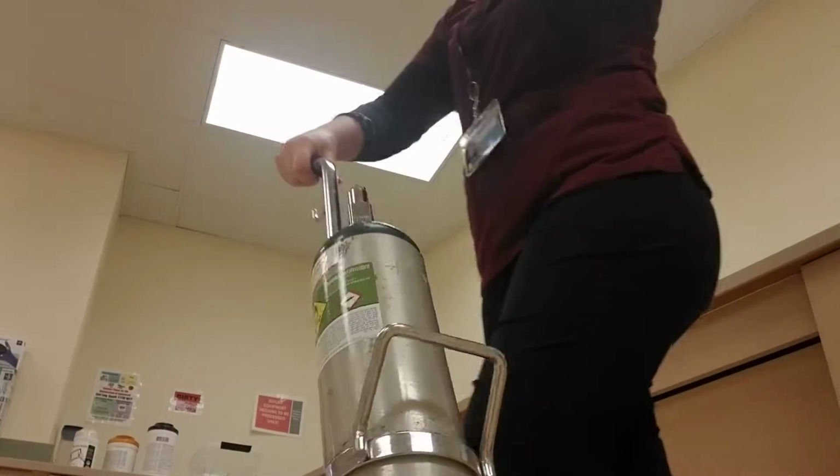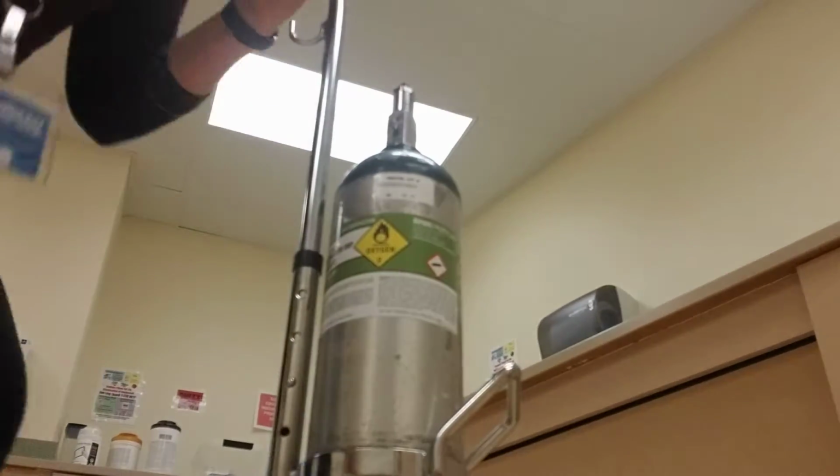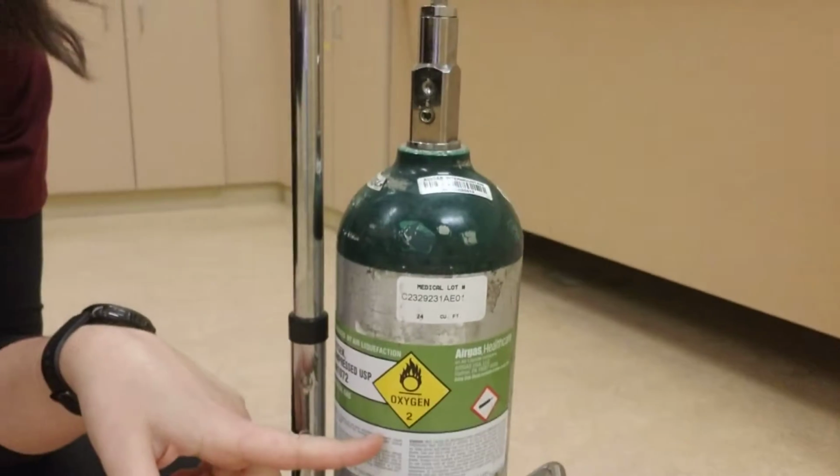I'm going to bring your oxygen tank over using this little trolley. Make sure it's secure, all upright position. We know it's an oxygen tank because of the green coloring. We can read the labels here. That's oxygen. You can see the little trolley that we have it in.